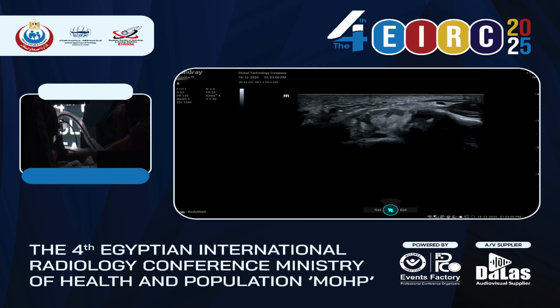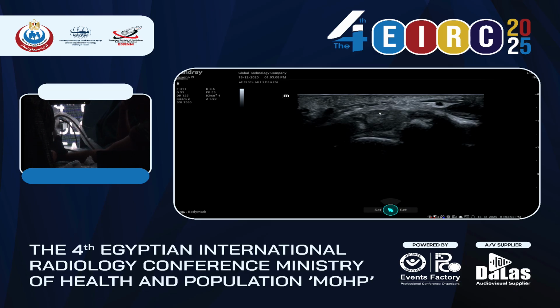So here, when I create a little movement with my probe, you see that the tendons become dark and bright, whereas the nerve doesn't change so much. If you're not experienced and you're not sure what is a nerve and what is a tendon, there are 2 ways to know. The nerve is always superficial underneath the flexor retinaculum, which is here, and the nerve, when you move, doesn't change so much by anisotropy like the tendons.